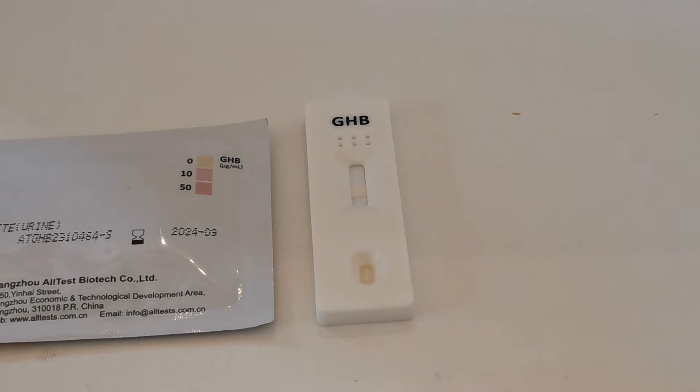We started the timer when we added the sample into the sample well. We're now at ten minutes and you must read this test. The accurate results are those showing at exactly ten minutes from when the sample was added.